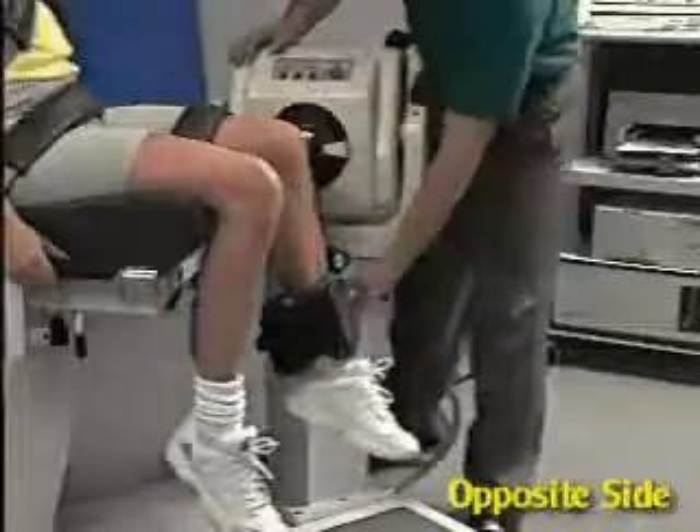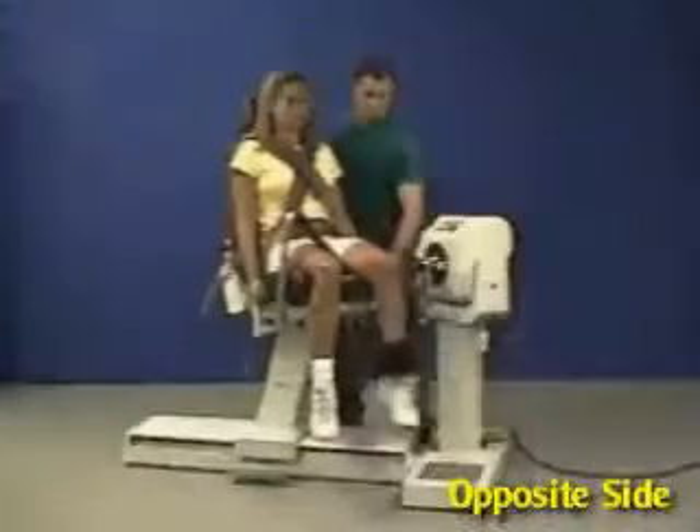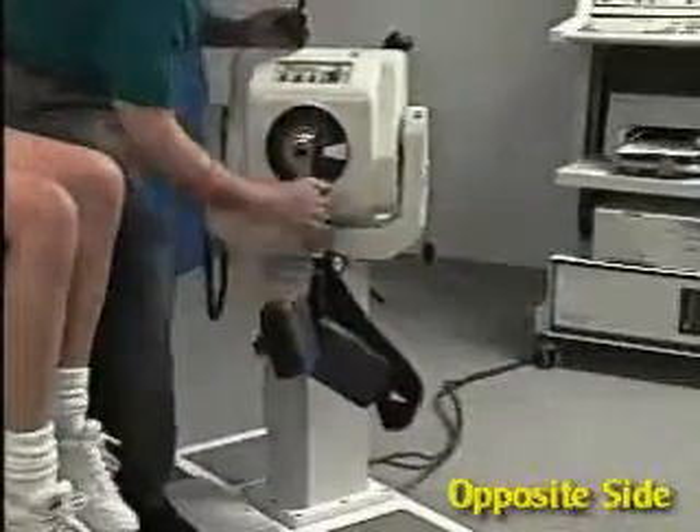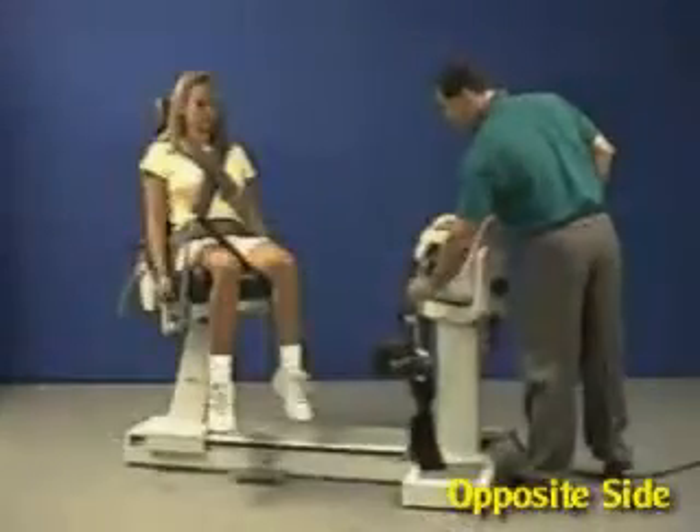For the opposite side, unstrap the patient from the attachment and slide the chair back. Exchange the fixture with the opposite side attachment, remembering to align the red dots.